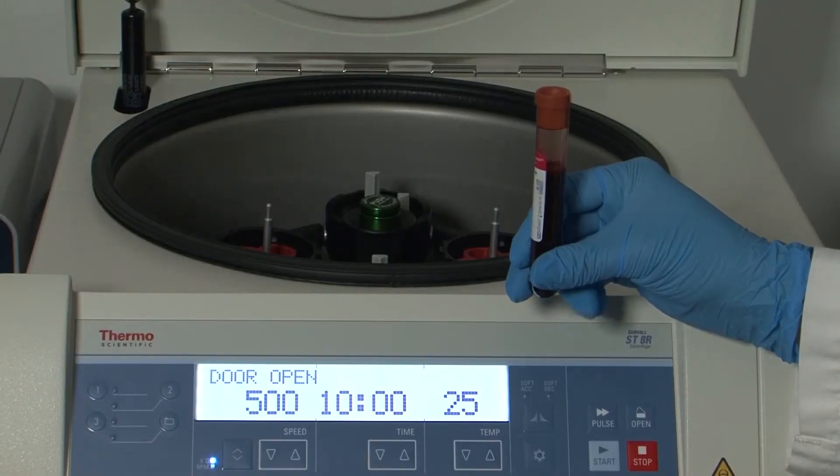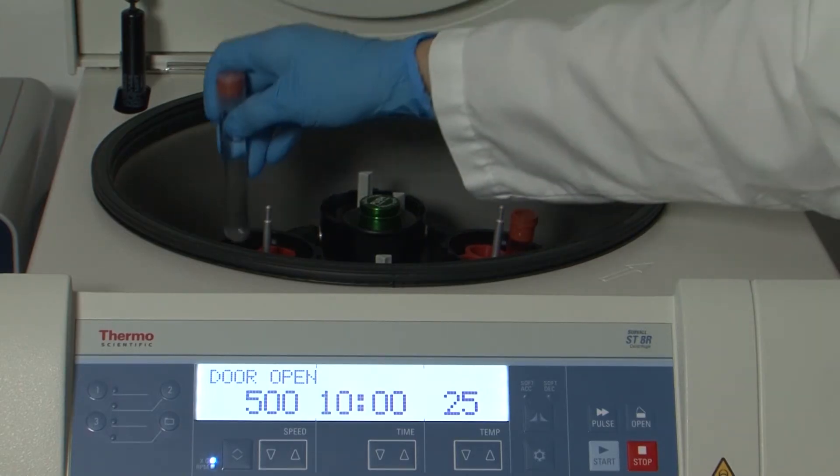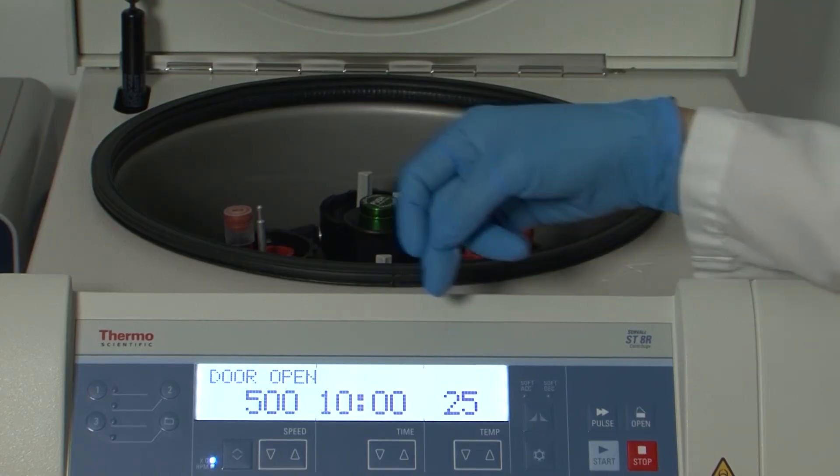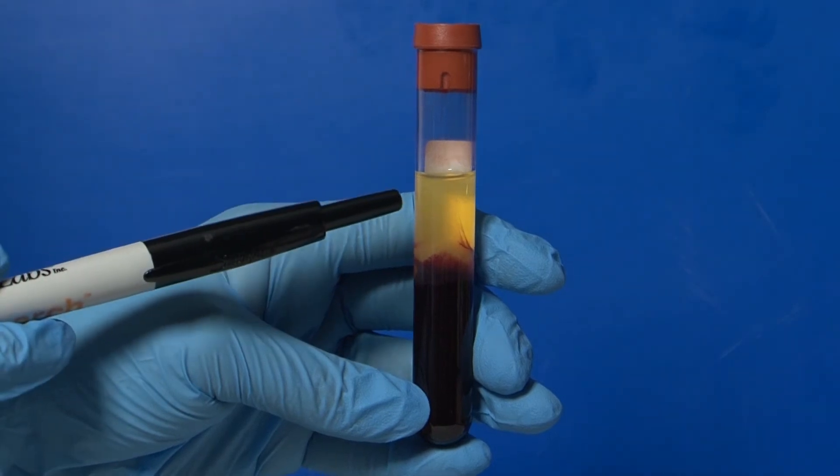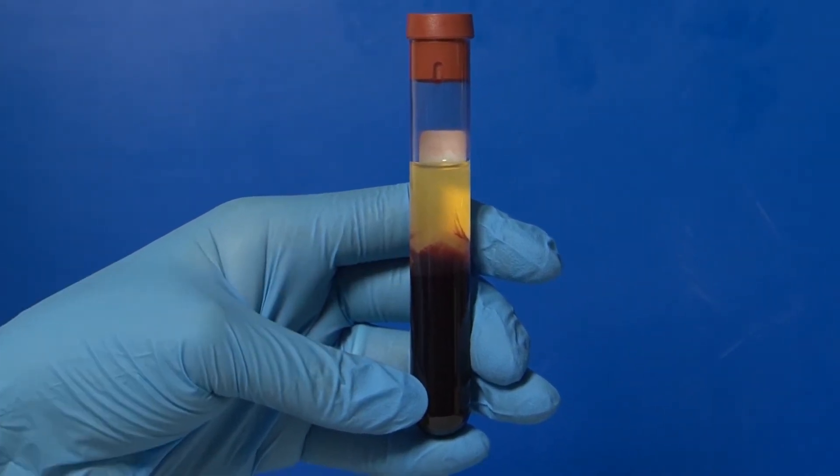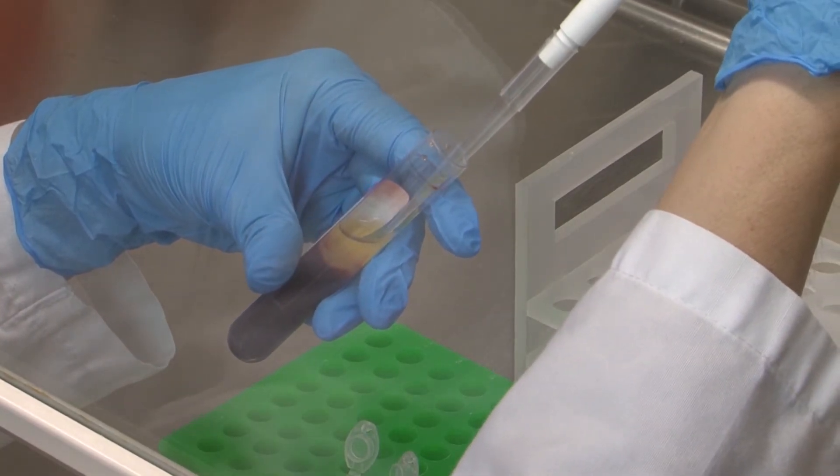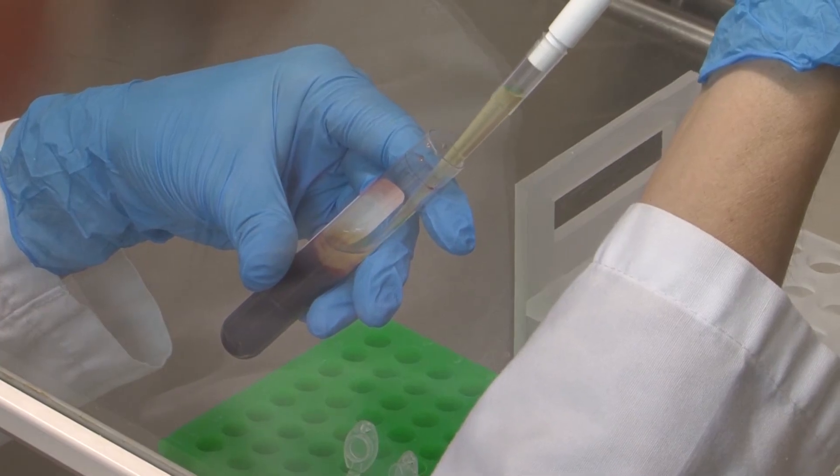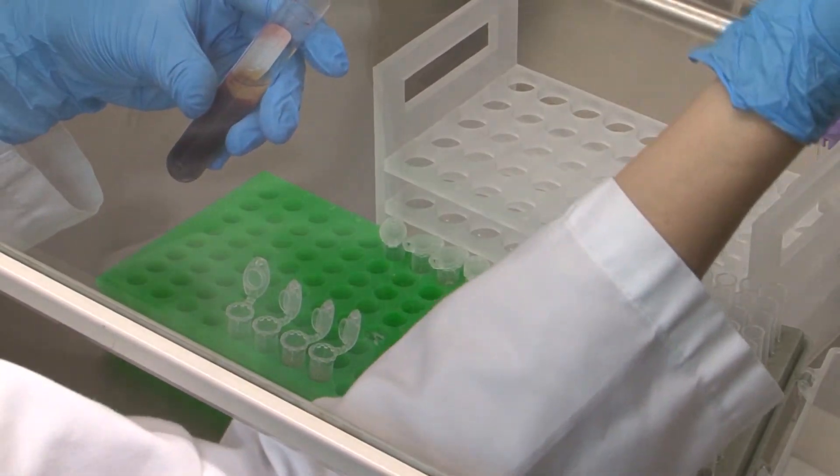The procedure with the red top tubes is the same. The only difference is that serum will be extracted rather than plasma. Centrifugation is again done at room temperature at a minimum of 500g for 10 minutes. Serum, which is the yellow fluid layer at the top of the tube, will be distinct from the blood clot. Serum can be separated from the blood clot using pipettes into one milliliter units and placed into plastic tubes. Care should be taken not to disturb the clotted portion of blood within the red top tube.